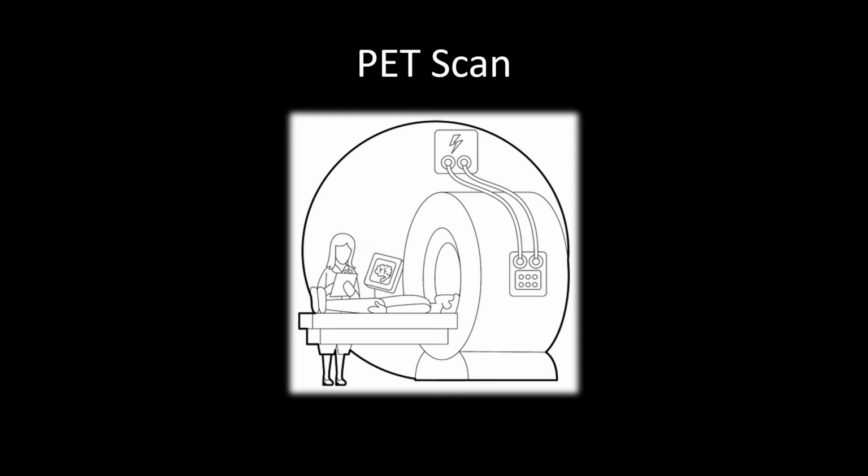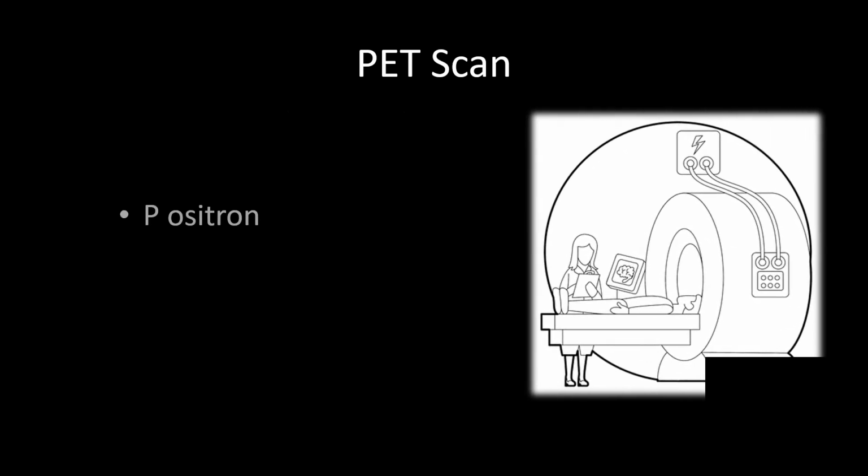Maybe you've heard of the term PET scan before. PET is a commonly used imaging technique used for both clinical and research purposes. For example, it is often used in oncology to detect tumors in possible cancer patients. The term PET stands for positron emission tomography.